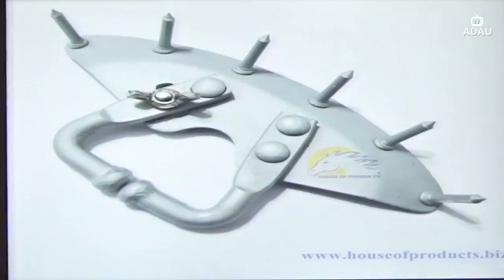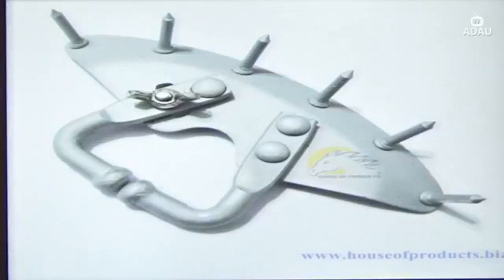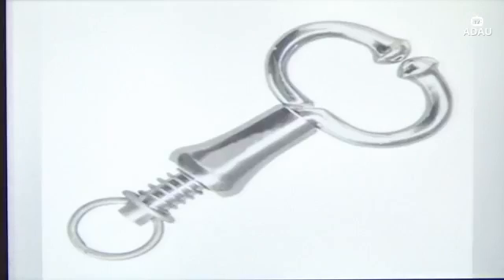This is an iron restricting ring which has needles. But I think this restricting ring causes a lot of damage because it is iron. At the present time we use nylon restricting rings, because they give a good effect after 10 days or 2 weeks, whereas iron may take 1 month and damages the udder of the cattle, and will make the condition of the cattle very difficult.